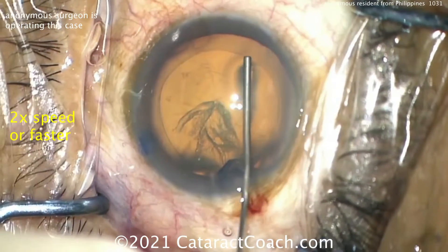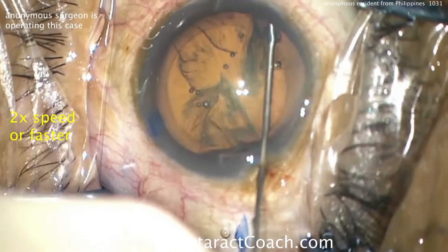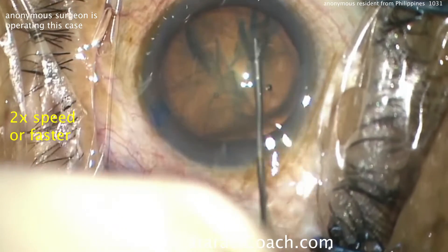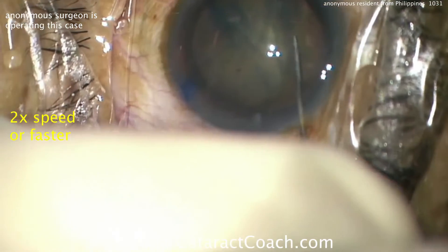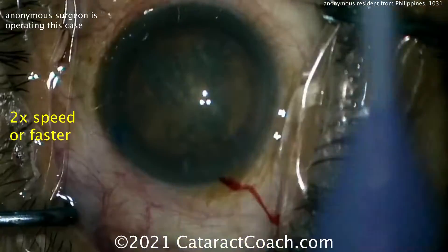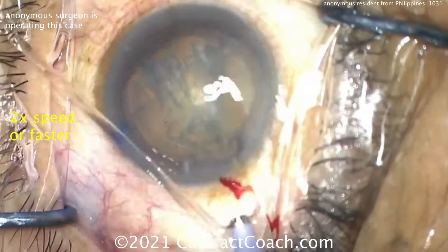Here's the hydrodissection — good, that's a good fluid wave, I'll take that. But look at all the loss of viscoelastic — a lot came out of the eye, so I hope we're going to replenish at least a little bit in the center. Trying to spin the nucleus — looks like it's pretty well dissected. Here comes the phaco probe.